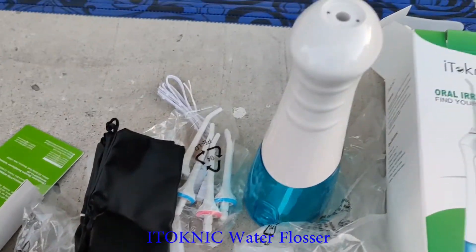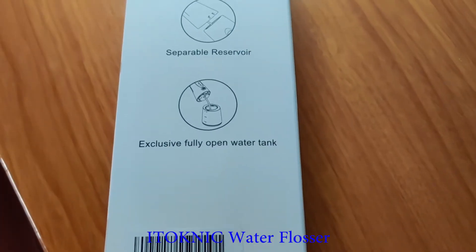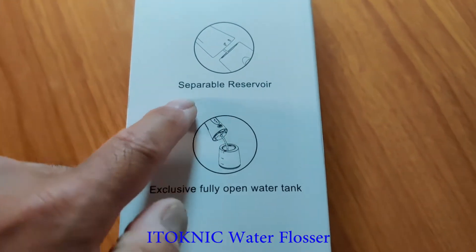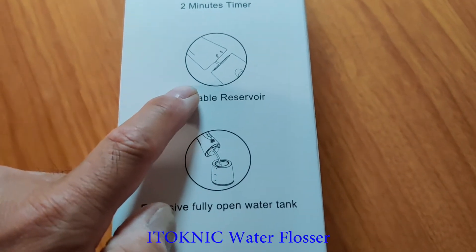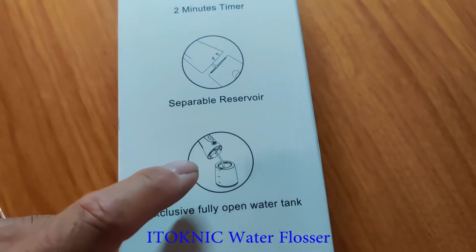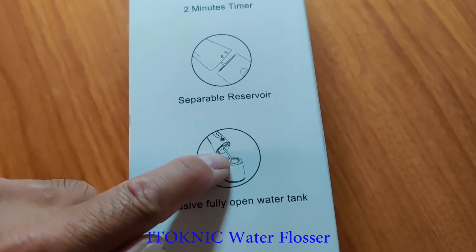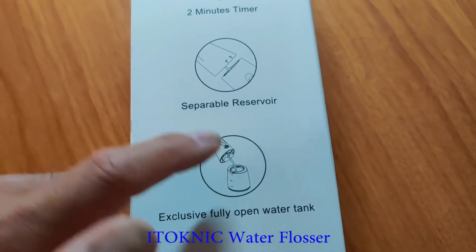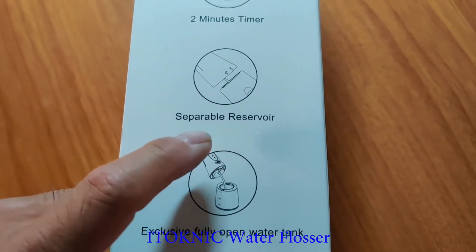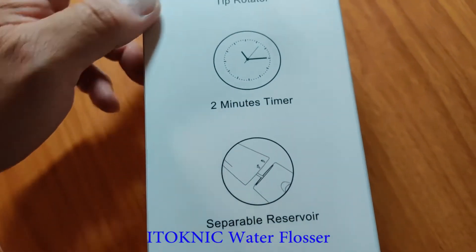Let's compare this to the others and see what the differences are. According to the box, you can actually separate the reservoir. I don't know what the meaning of this is because this little tube is very short, but I don't know why they even let you detach it. I guess it's to help dump water and maybe for cleaning inside.